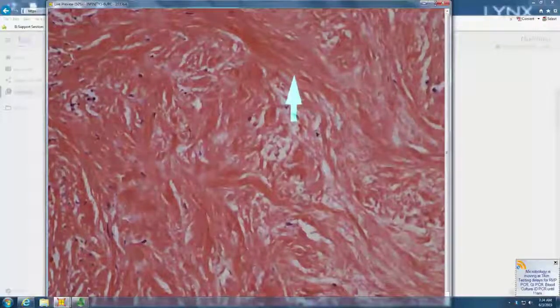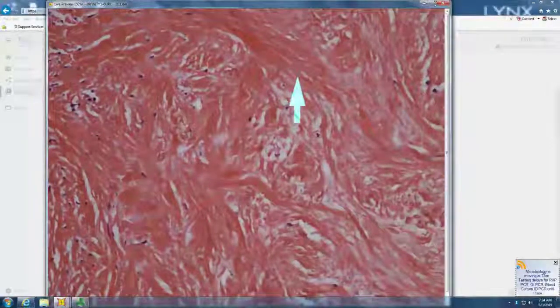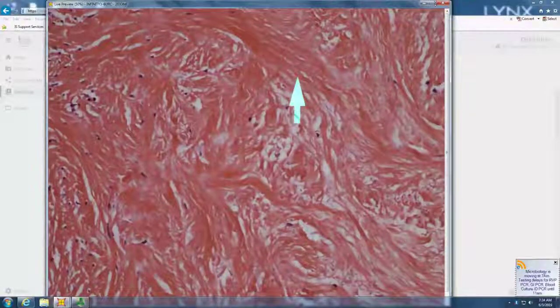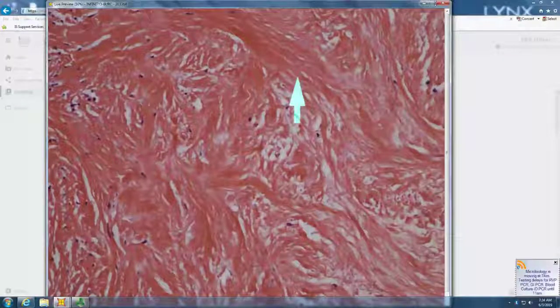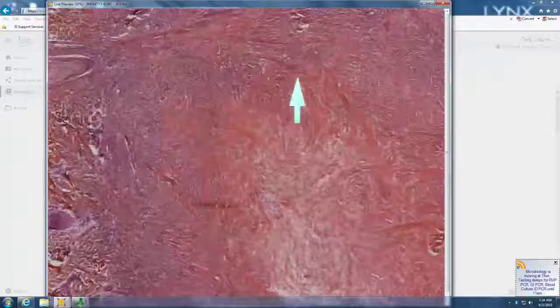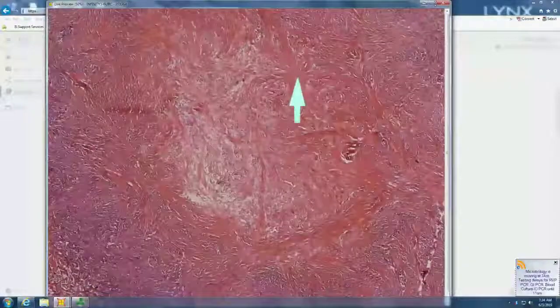Some ropey fibers there. So you still see ropey fibers, which is very different from the necrosis or necrobiosis that you would get in NLD or NXG. Here, it's still intact collagen fibers. It's become hypocellular, but the collagen itself is not necrotic.